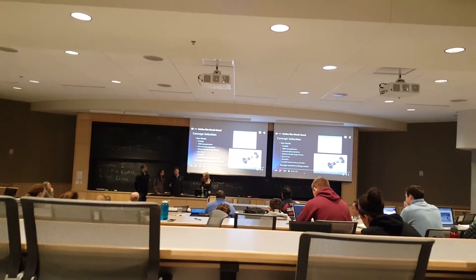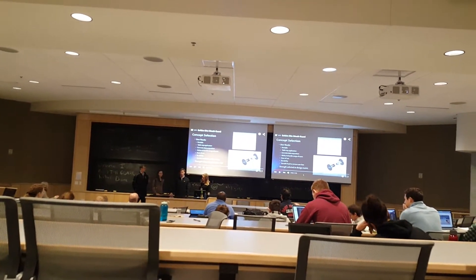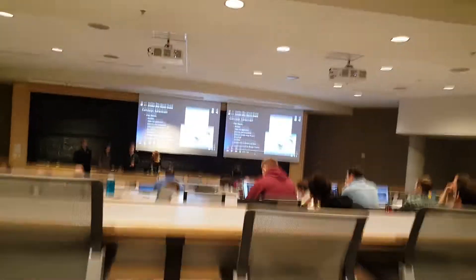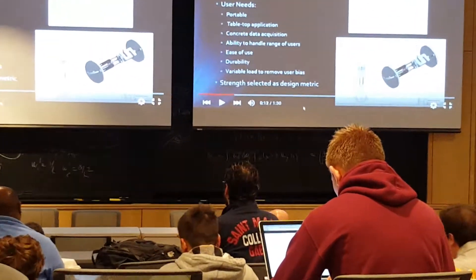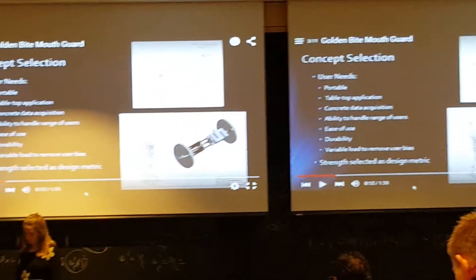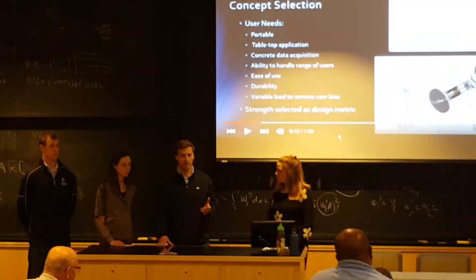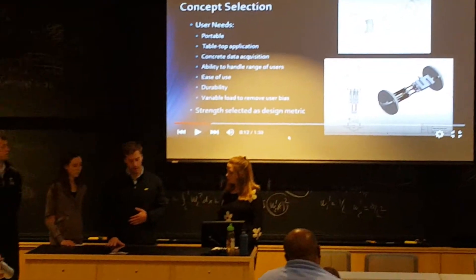In the top right you can see our initial prototype sketch that we were going to pursue. In the bottom right, after we were faced with the variable load idea in the middle of the semester, we had to come up with a different design. You can see the CAD drawing of our final product.